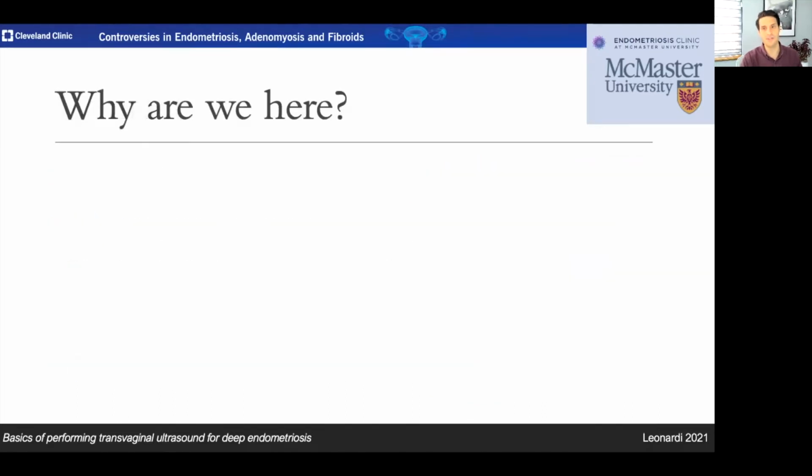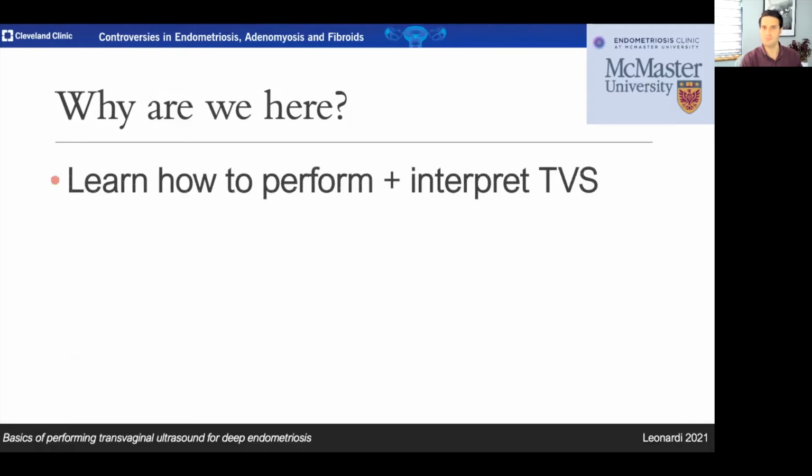So why are we here today? Unfortunately, I can't ask you because of the virtual nature of this talk, but I can guess that you're here to learn. You may be a gynecologist who's keen to learn how to perform ultrasound. You may be a radiologist or a sonographer. You may be a training individual in one of those realms. So yeah, learning how to perform and interpret transvaginal ultrasound is probably the main objective. But what's the real reason behind that?